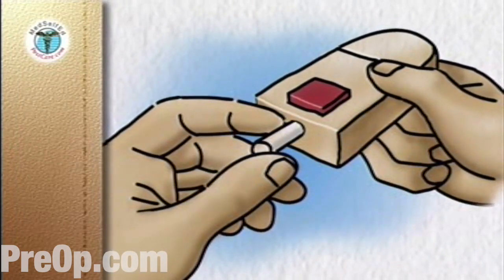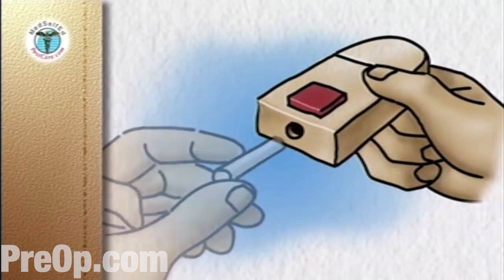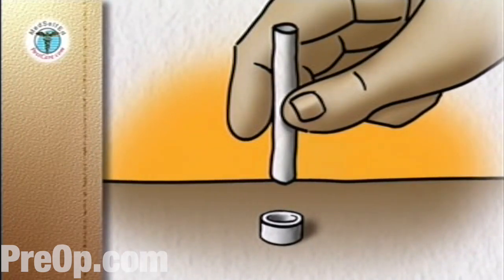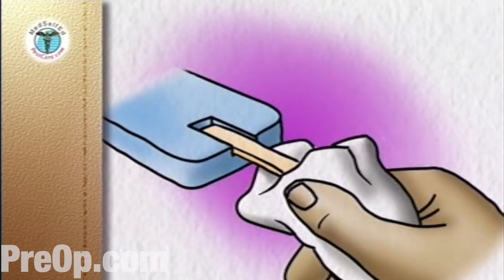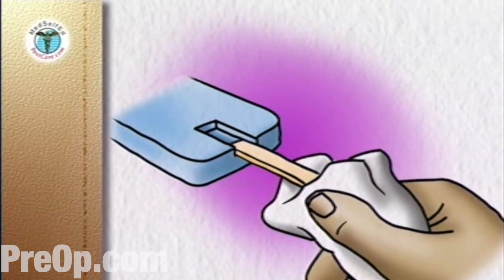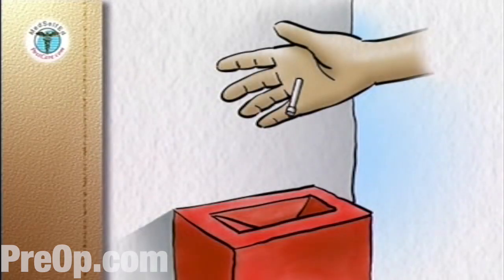Remove the end cap from the lancing device and remove the used lancet. Replace the used lancet back into the protective cap by pushing it into the open end of the cap, which is placed on a firm, flat surface like a countertop. Once the blood sugar reading on the meter is complete, use the tissue to grasp the test strip and pull it out of the meter. This usually turns the meter off. Discard the lancet in its protective cover and the used strip into a glass or puncture-proof container with a screw top, or a sharps container purchased from your local pharmacy.